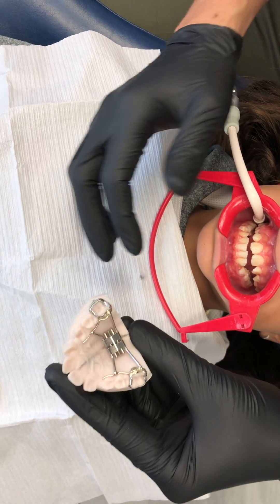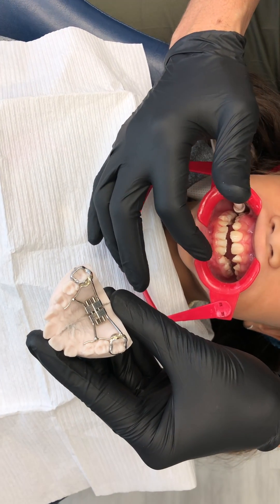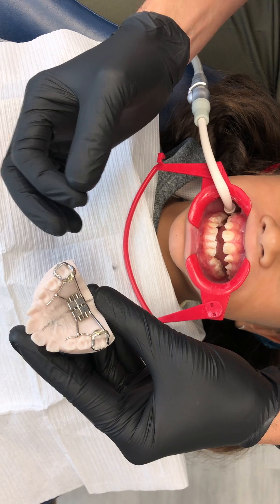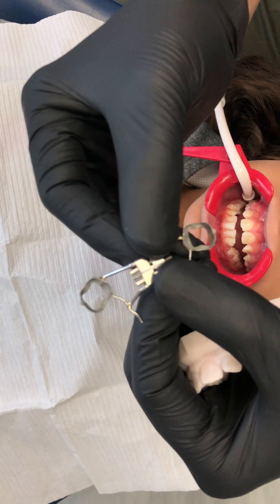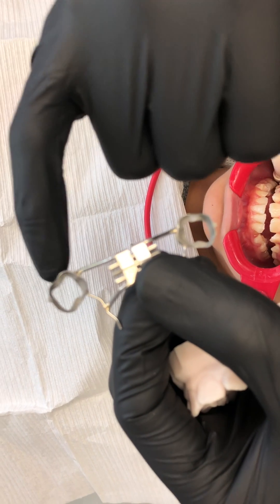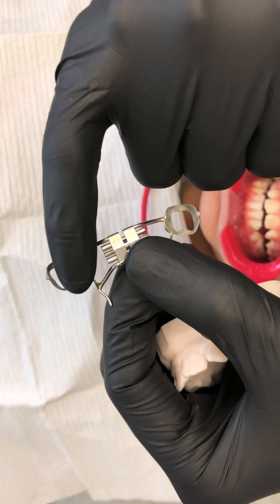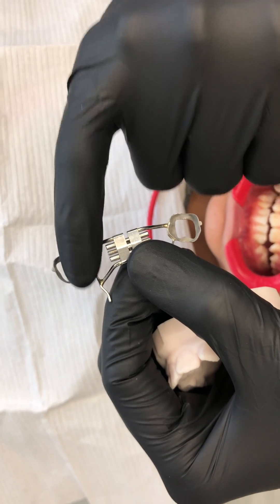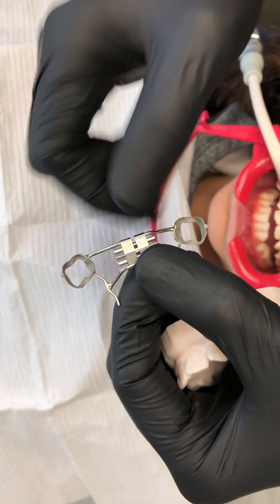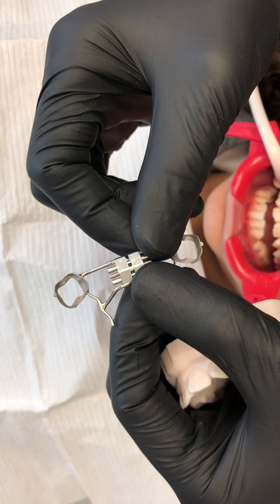What we're going to do now is etch the entire surface of her upper molars. These bands are already micro-etched inside, but just to make sure we get extra adhesion of the BandLock, we're going to place some Assure on here and cure it. We'll do that first while prepping the teeth.